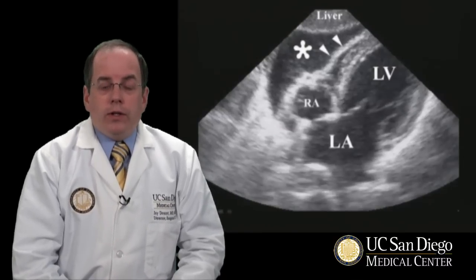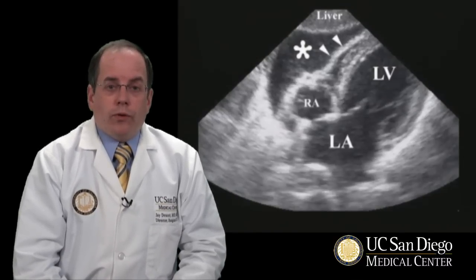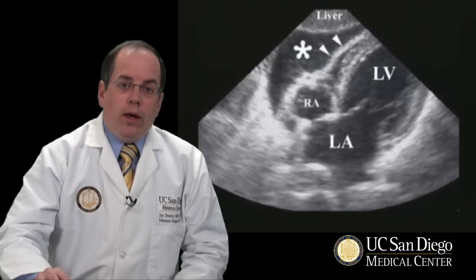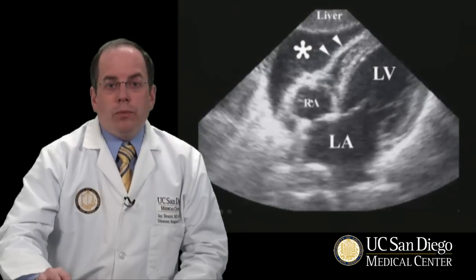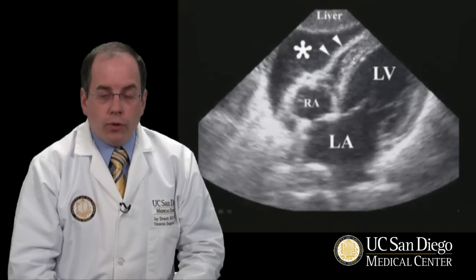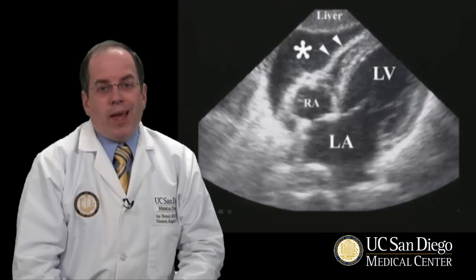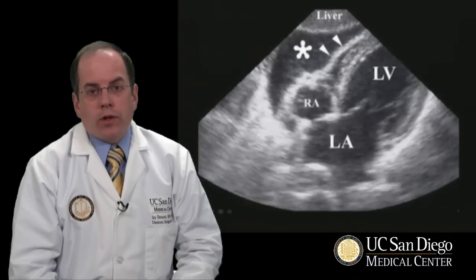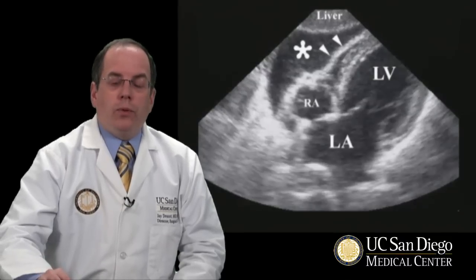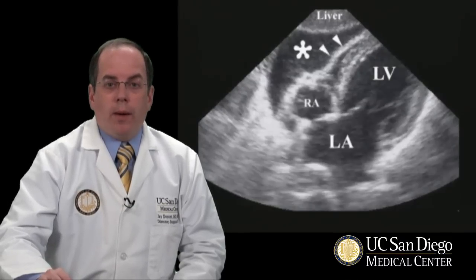Also examined at the same time is the subxiphoid window looking up towards the heart. In this case, we can see the heart shows up very well. The left ventricle and left atrium are here. This is the right atrium. But in addition, between the liver and the pericardium, there should be no black fluid. However, in this example, the asterisk marks the presence of fluid between the liver and the heart, which is pathognomonic of a patient with pericardial effusion or tamponade.